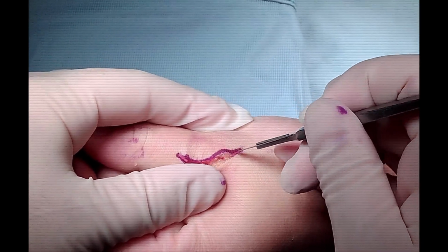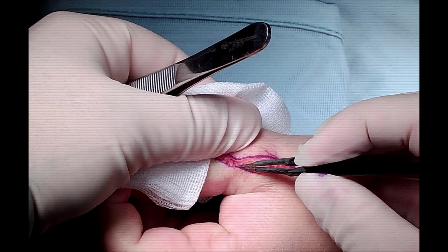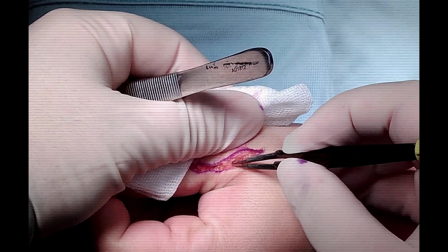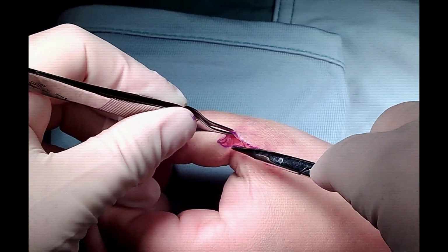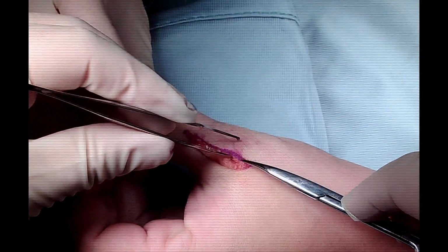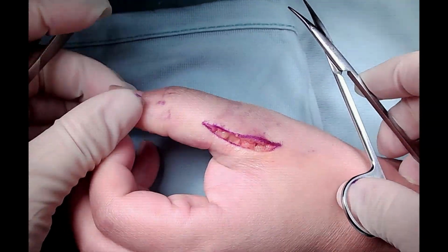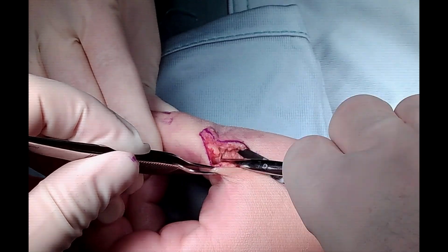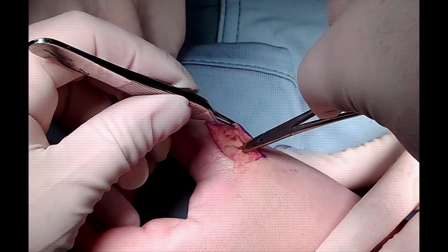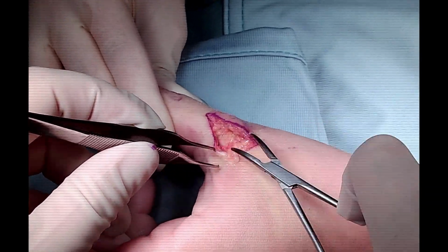The approach is straightforward with a curved incision on the ulnar side of the thumb, followed by gentle dissection of the soft tissue. Care should be taken not to injure the dorsal branch of the sensory nerve on the dorsum of the thumb. Following dissection of the soft tissue, the subcutis, we recognize the sensory branch and keep it safe dorsally with a retractor.